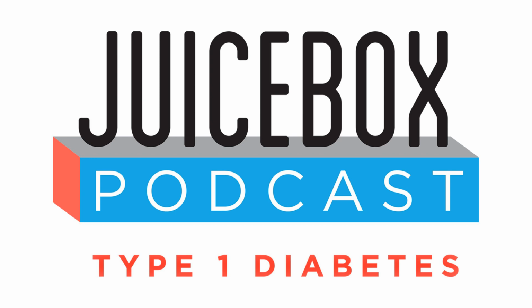Betabionics.com, the pump's called iLet. It's a very simple marketing plan, which tells you how simple the pump is. The front page just says, the iLet is an automated insulin delivery system that reduces the need to make decisions about your diabetes management because it makes the decisions for you. There's no more carb counting, correction factors, carb ratios, preset basal rates, or any other settings that might be overwhelming about other insulin delivery devices. And that's it. Correct. The iLet just needs one number, your weight. That's the end of the website. Right. So, there are some minor adjustables in terms of.